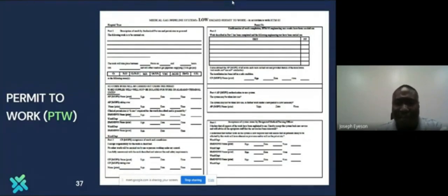For low hazard, maybe you have a pipeline installed in an entire place and there is a leak on an outlet; you need a permit to be able to tamper with the outlet. These documents need to be signed to allow you to go and work on the system. Because if it's low hazard and it's an outlet, you can only go and close a valve and then change it as early as possible without interfering with the flow of gas into any other areas.